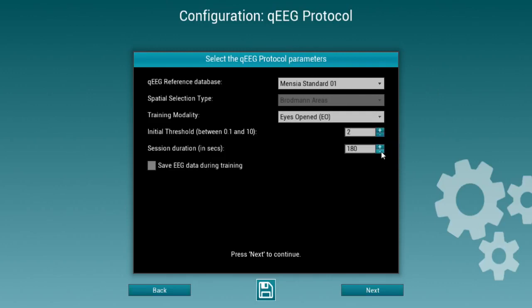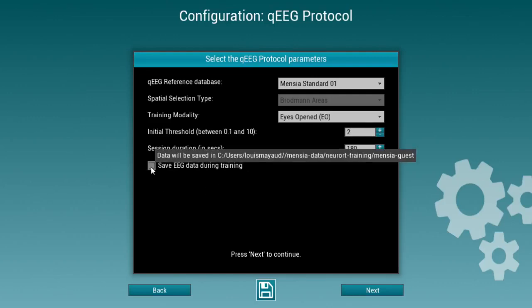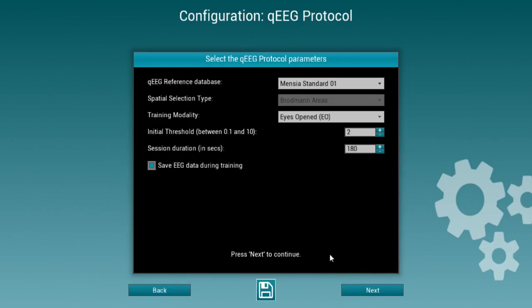Finally, you have to decide on the session duration and set an initial threshold which you can then adjust. If you want to save the EEG data during the training, do not forget to tick this box.